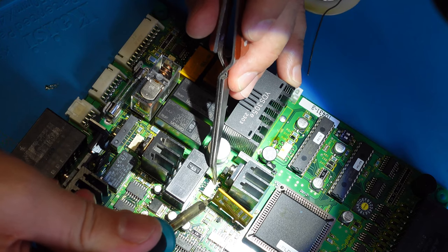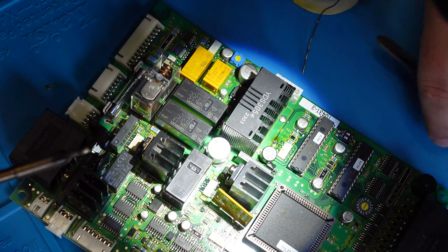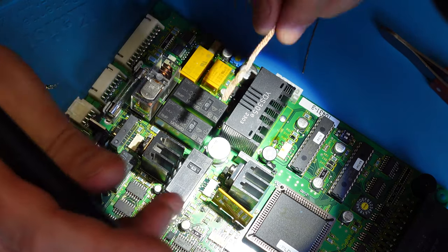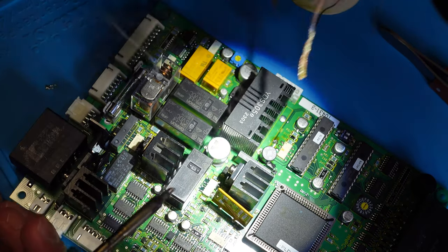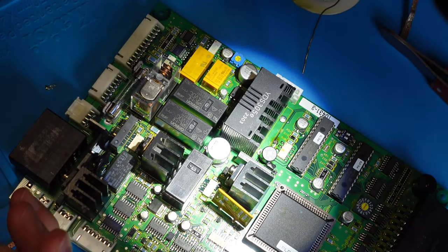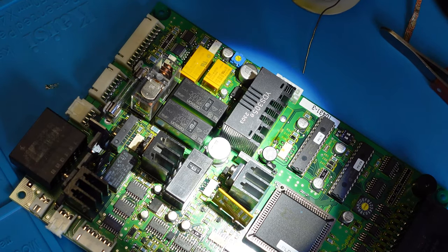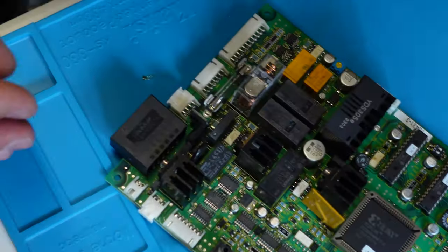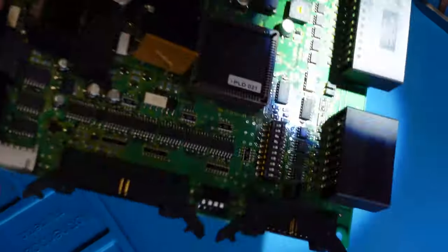And this one's a little bit more of a challenge. There we go. I got a little bit of a bridge going on down there, because of the angle from this capacitor right here. So what I'm going to do is just suck a little bit up and check it in the microscope to make sure that all the legs are tacked down. Hopefully they are. That looks a hell of a lot better.